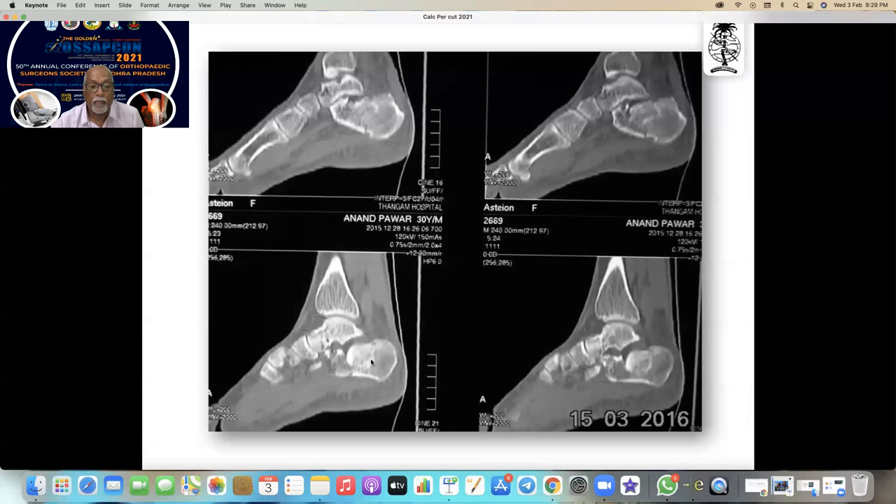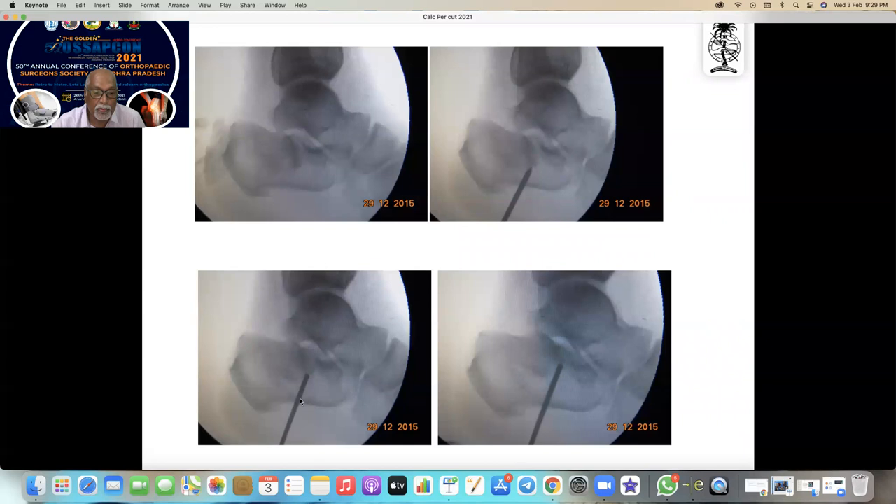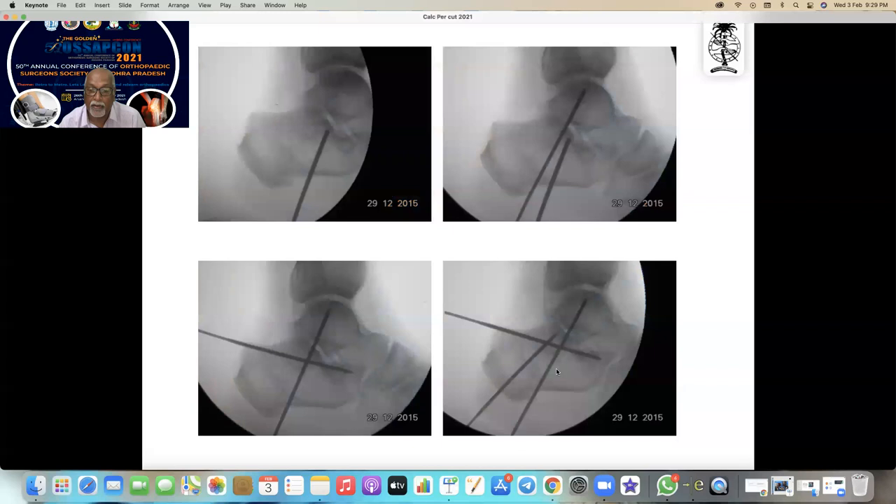You can see the fracture and the depression. I have to distract it backwards and elevate it back into position. The middle fragment — or the sustentaculum tali — always remains in position. I put a K-wire, then a 2.5mm wire reaching the depressed fragment, and you can see it going up as I hammer it and bring it back into position. Once it comes to position, I lock it by another wire. The talus is the one who created all the problems — so let it be his responsibility to maintain the calcaneum.